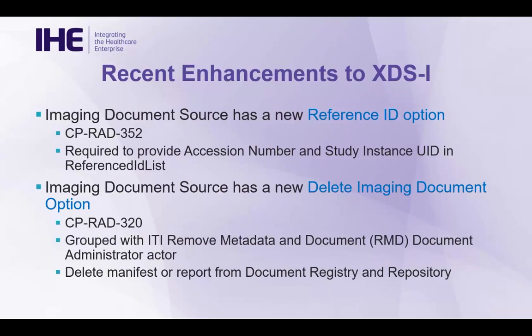There are two recent CPs, both of which have already been incorporated into the technical framework. We're just about to release a new version, revision 17 or 18, of the technical framework. So make sure that in the next couple of days you go to the IHE website to download the latest version.